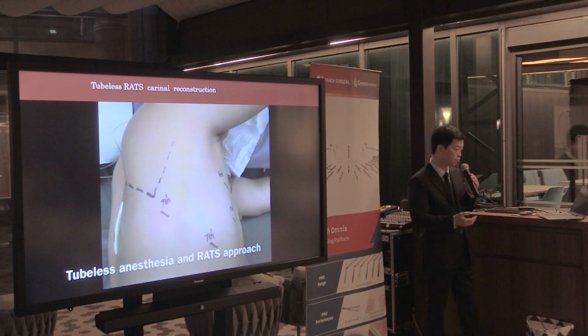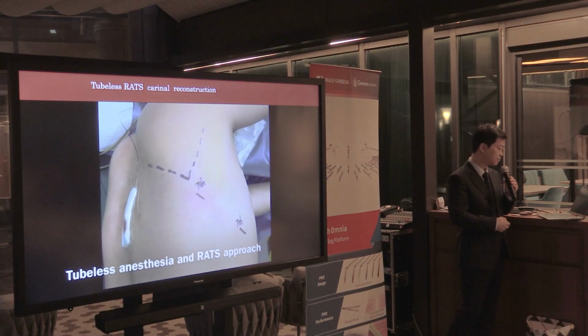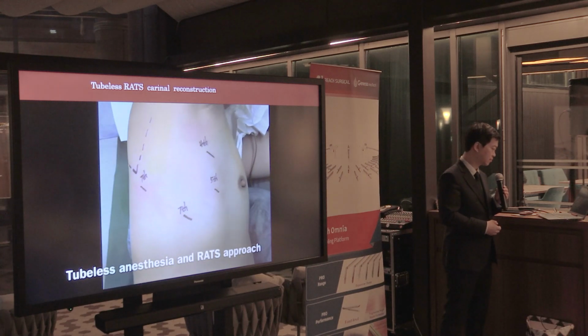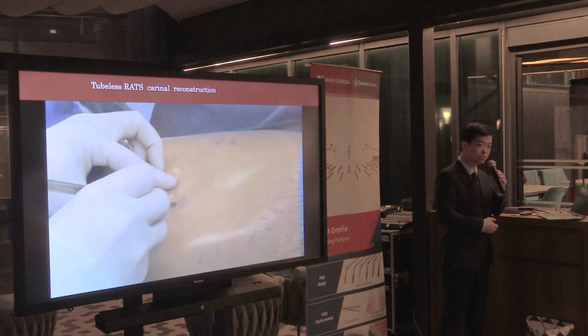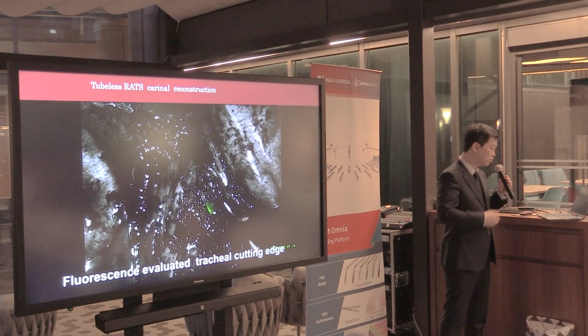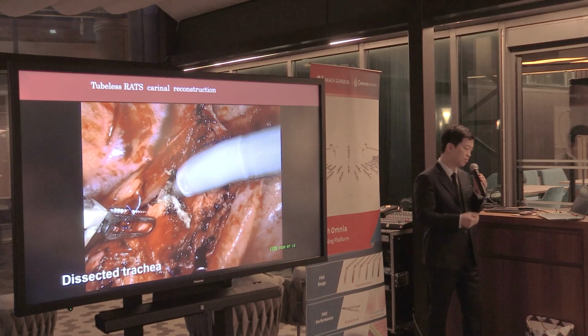Now the patient just received non-intubated anesthesia, from skin to skin. We also use the XI fluorescent to evaluate the proper margin.